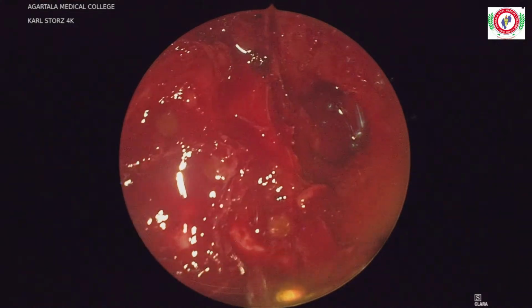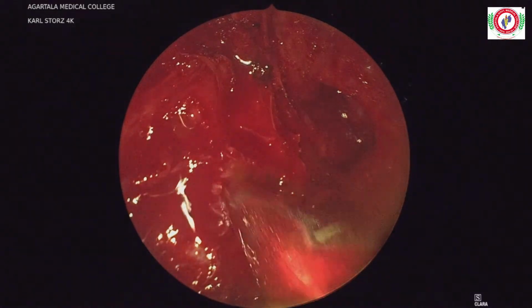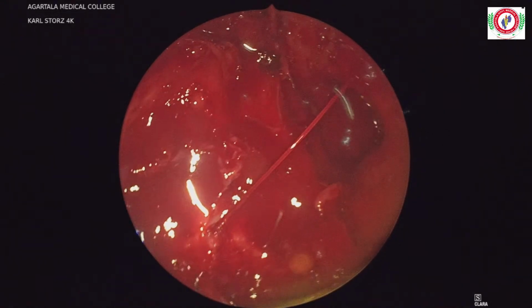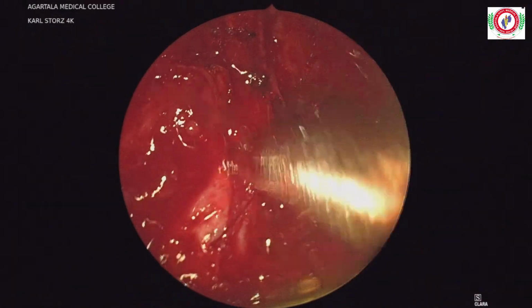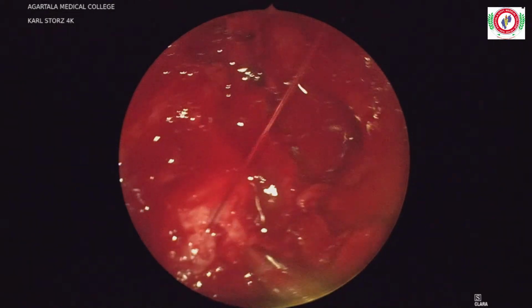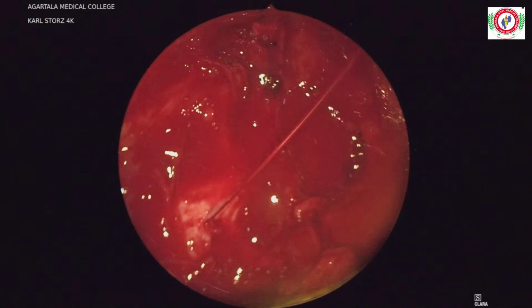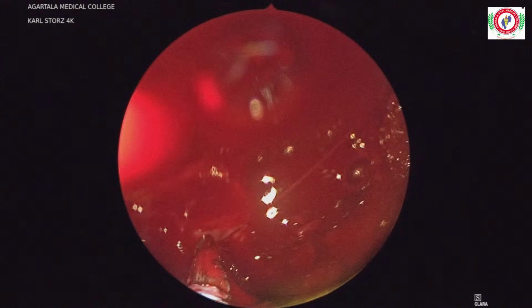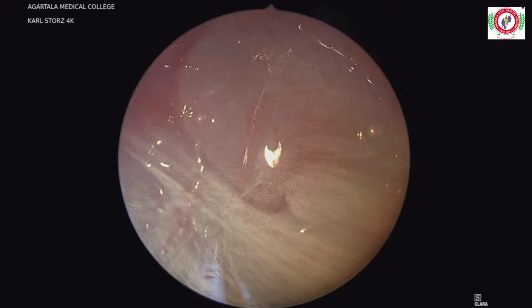Now give me the debrider. Yes. I think this was where the tumor was arising. Can you see this attachment here? You see how it is getting the vascularity from here. So that is where it was getting its attachment, from the posterior wall. Maybe it's a branch of the... Yes, it's a spurter now. Give me a bipolar.